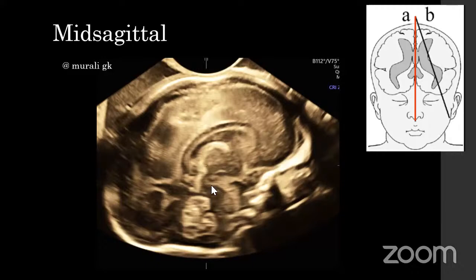So in a sagittal view, I'll repeat once again. Another important aspect: the tela choroidea ends anteriorly at the level of the foramen of Monro. So it forms this line. What lies anterior to this line is the cavum septum pellucidum. What lies posterior to this line is the cavum vergae. So the anterior margin or dipping of the tela choroidea is a point of division between the cavum septum pellucidum anteriorly and the cavum vergae posteriorly. So I'll revise this once again.